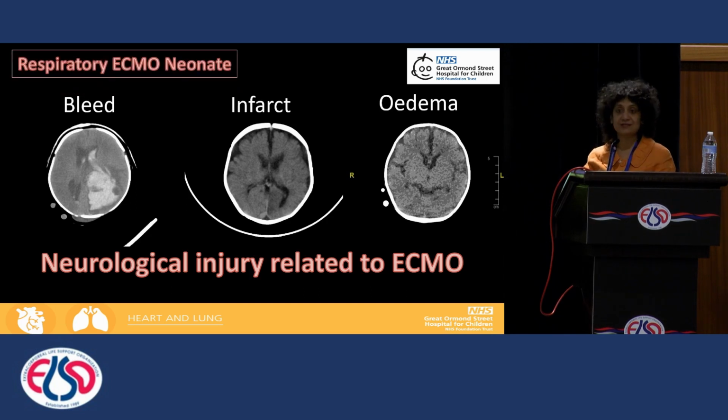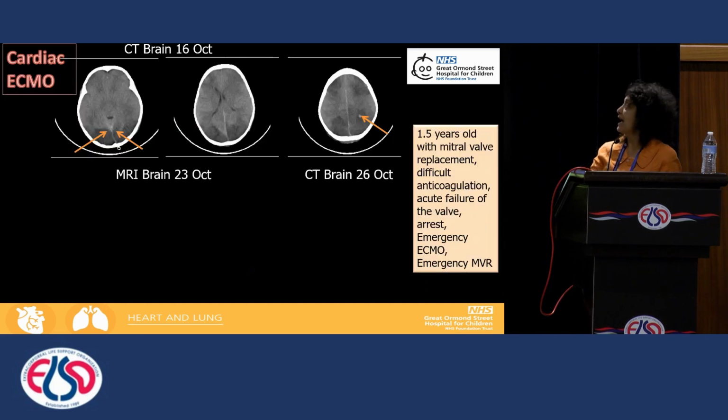These are all scans from children supported on respiratory ECMO, neonates. And I show you here a series of scans on a 1.5-year-old child, post-cardiac ECMO.